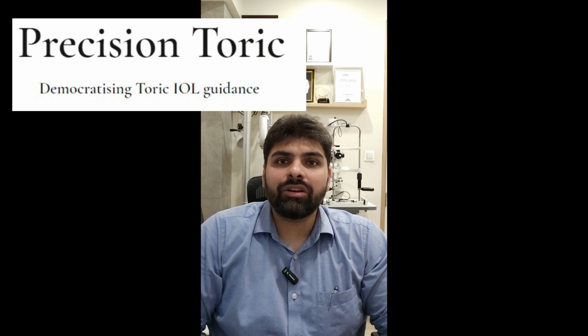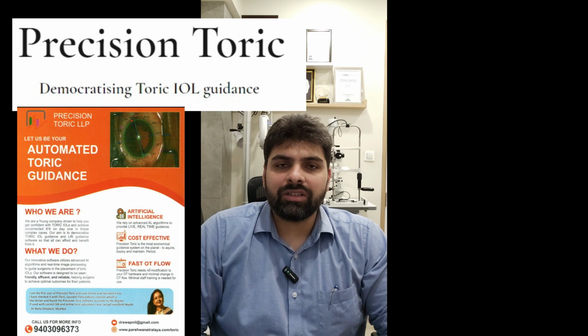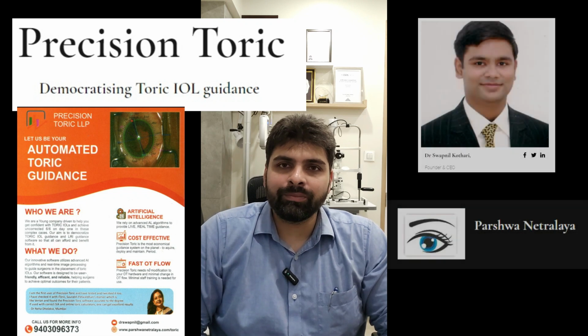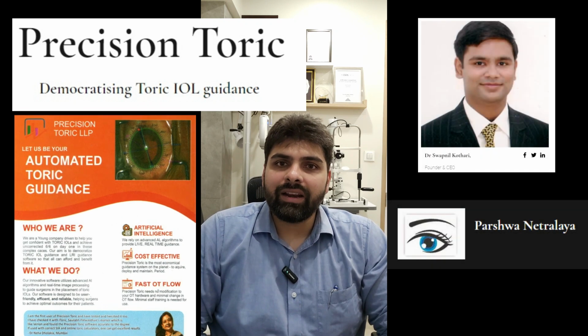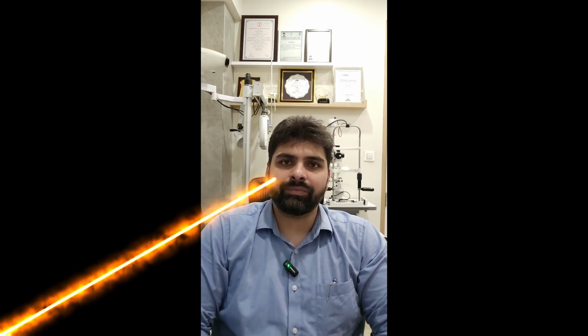So I am very excited to share with you all that for the Toric IOL planning part of this surgery, we are going to be using the Precision TORIC guidance system, which has been developed by an ophthalmologist, Dr. Swapnil Kothari from Jalgaon. And this basically is an intraoperative image guided system for Toric IOL placement. So before I show you the planning of the case, I'll just show you what exactly is the hardware required for the Precision Toric guidance system, and we'll move to the operation theater to see this.